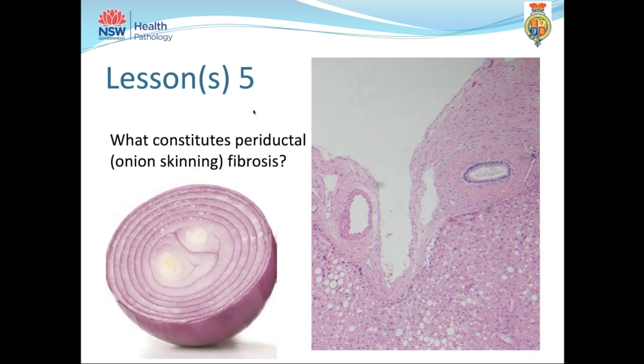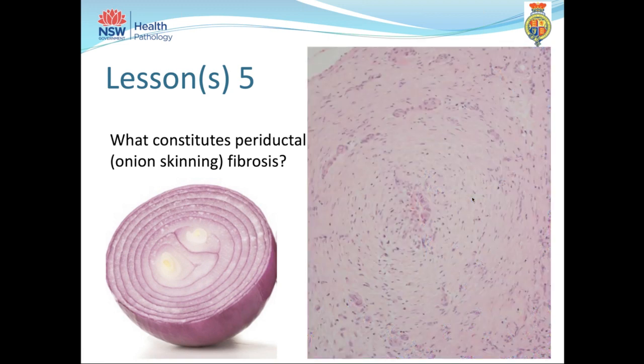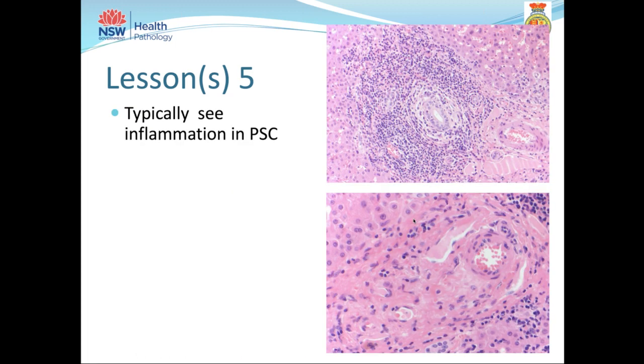The brief points I wanted to raise are, firstly, I think we see, again, in some of these review cases, a bit of perhaps overcalling of onion skinning fibrosis. There is normally quite a dense concentric layer of collagen around bile ducts. To call something onion skinning or periductal fibrosis, I like to see this looser, more edematous look to the periductal fibrosis, and of course the presence of duct damage.